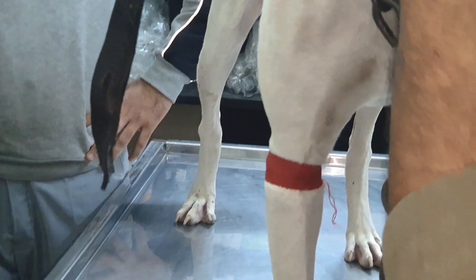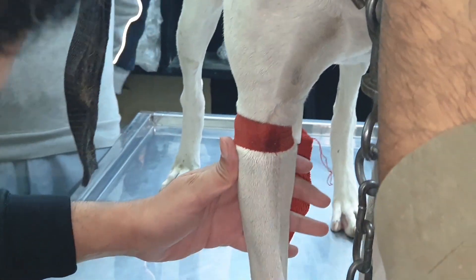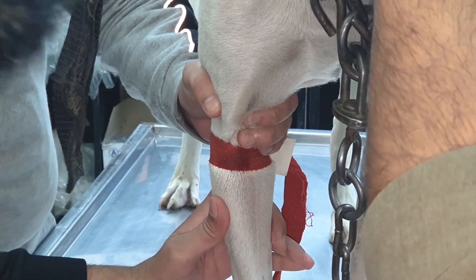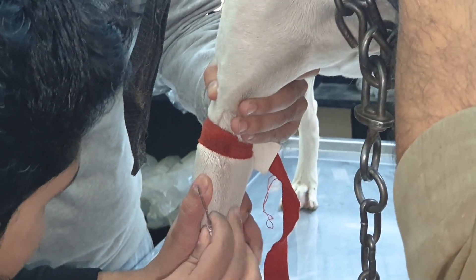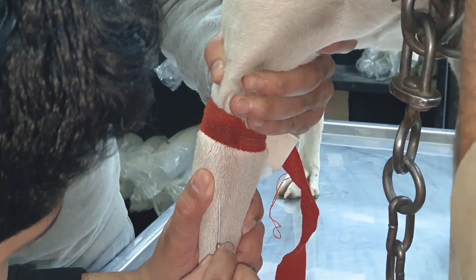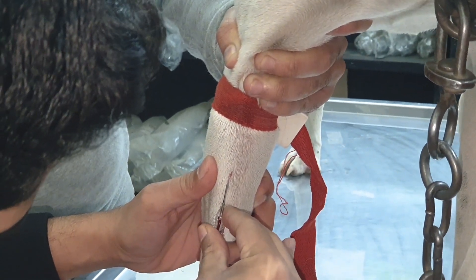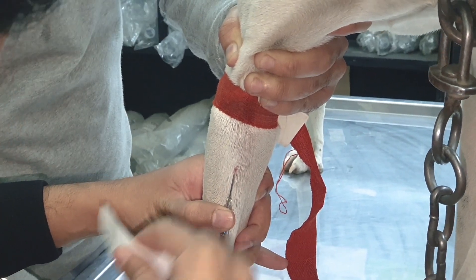In this video, you are going to see that we first place a tourniquet right above the cephalic vein, then sanitize it to make the vein prominent. You can see in the video how we place the needle in the vein, and after that we fix it with tape so it won't move.